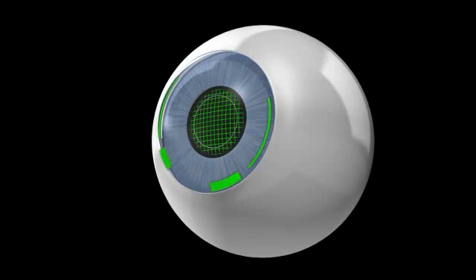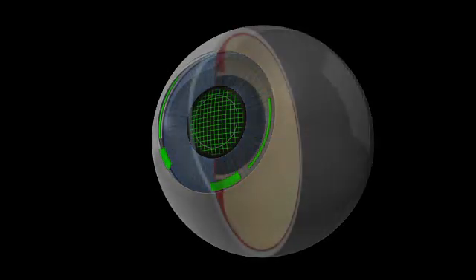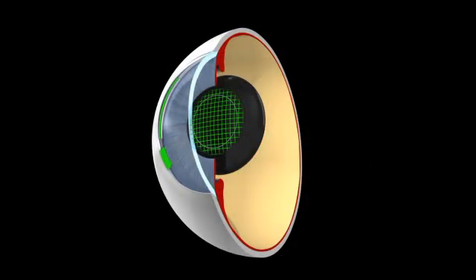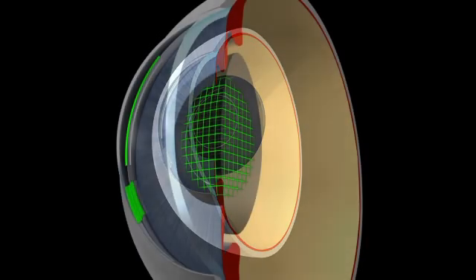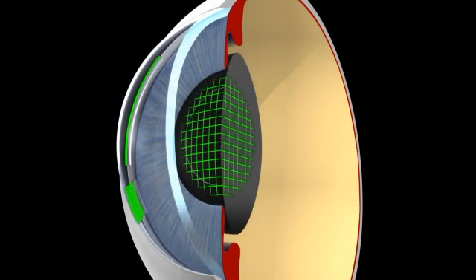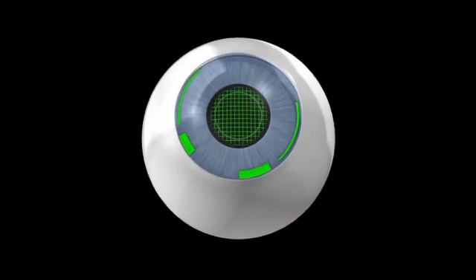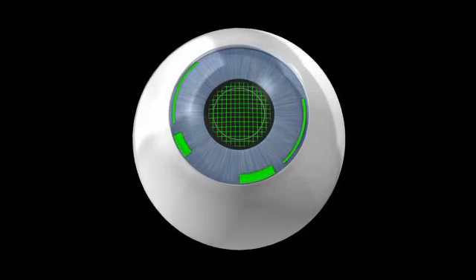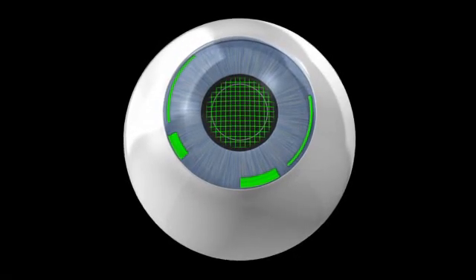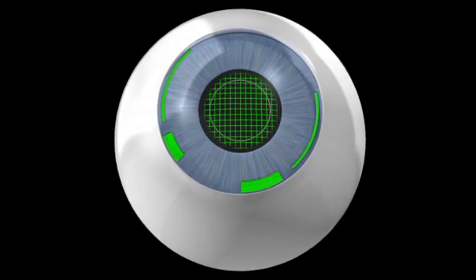All the critical incisions, such as LRIs, CCIs, the capsulotomy, and cataract fragmentation, will have been completed in a single procedure. A significant advantage in terms of time and predictability prior to material aspiration and IOL insertion.